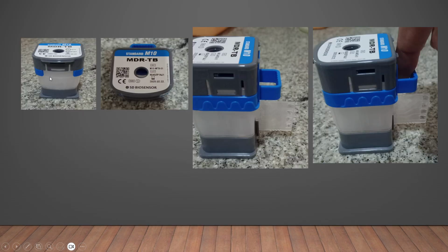Always make sure that, before you start working, the cartridge is taken out. At least 15 to 20 minutes the cartridge should be at room temperature. So make sure about that. Don't take the cartridge at this time, because it will still be cold from the refrigerator and will not work properly. Make sure it is kept at room temperature for at least 15 minutes.